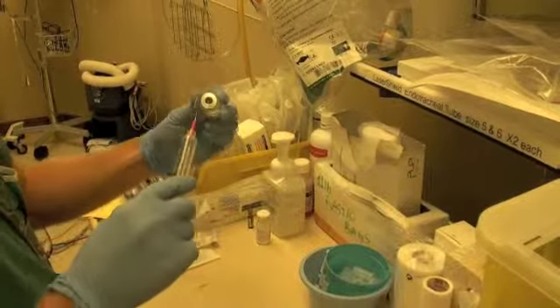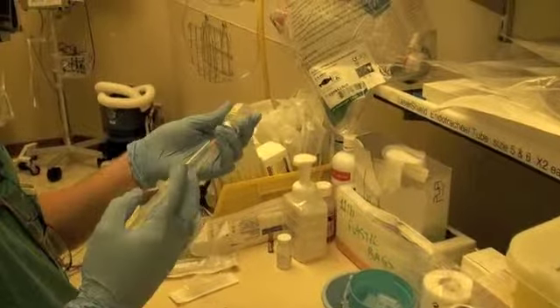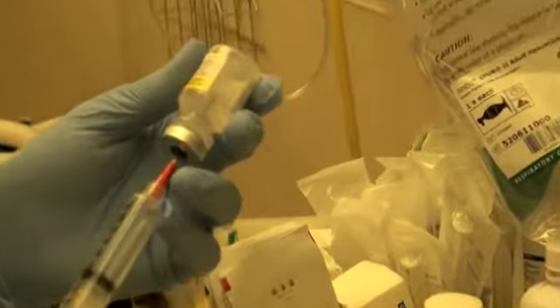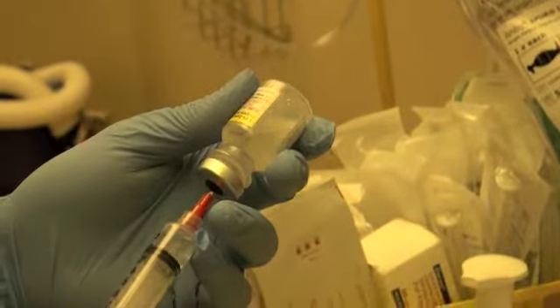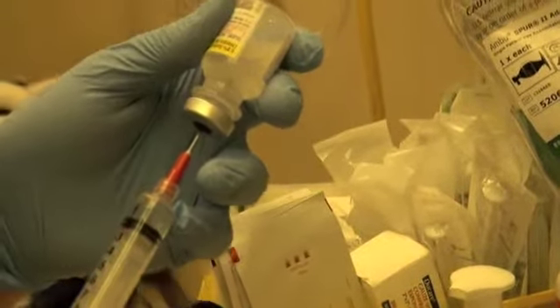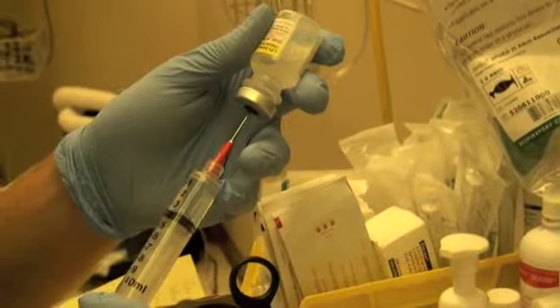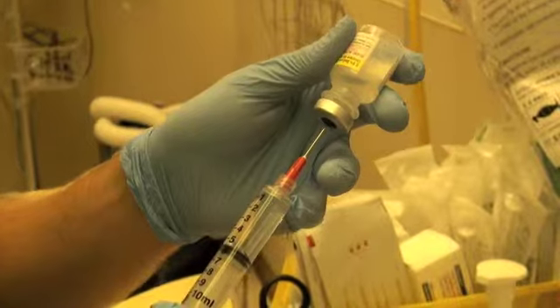Pop the cap off, insert the needle, and slowly inject the air into the vial. And then we'll let the fluid drain out. And at this point, you want to be careful that the needle itself is beneath the meniscus of the fluid, so that fluid keeps getting pulled back into the syringe.